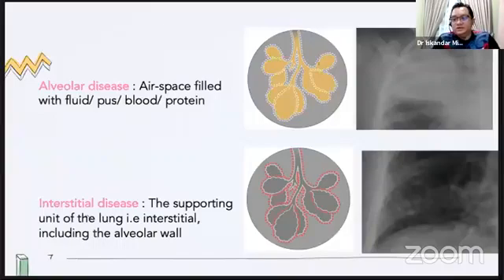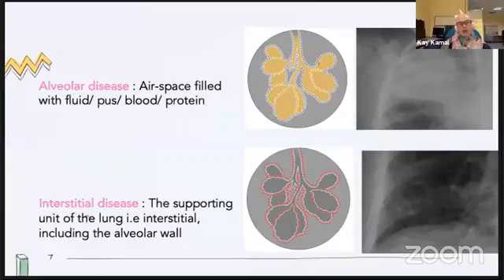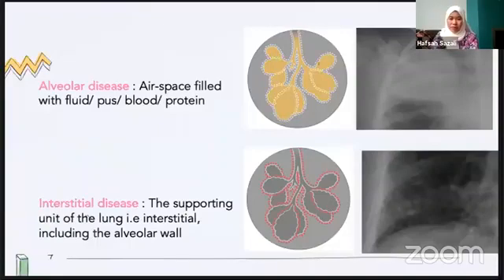Okay. The last question will be from Apip. Hi doctor, how to differentiate between air under diaphragm and gas under diaphragm? Same code. Okay, I think he meant air under the diaphragm versus stomach air. The same air. I think that's what he meant.